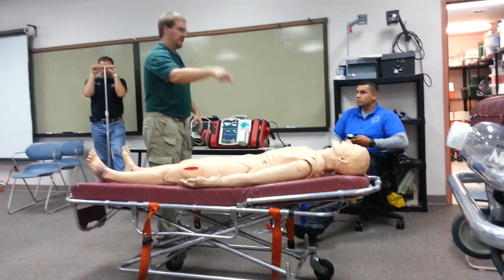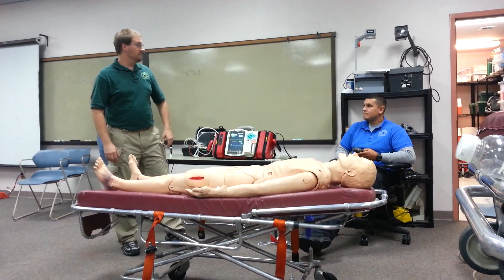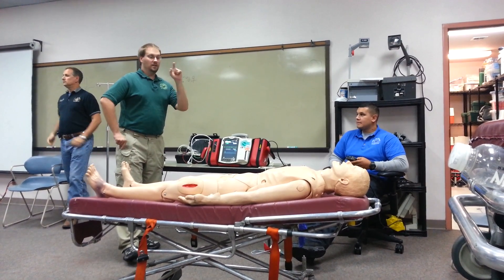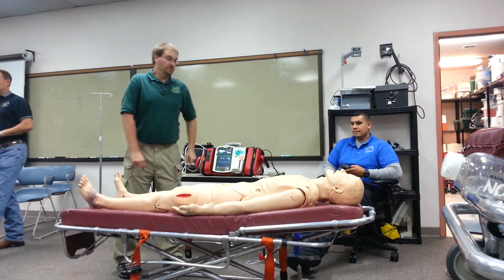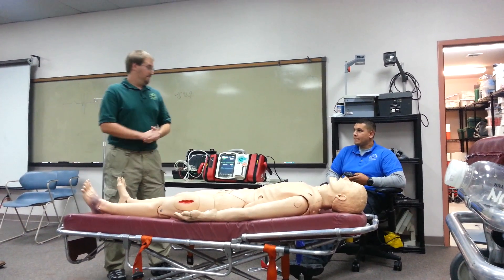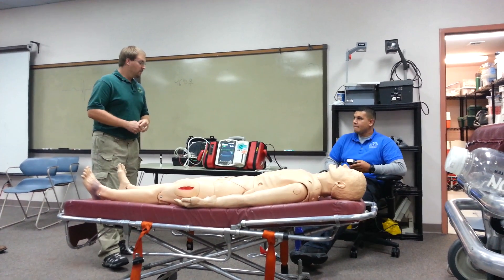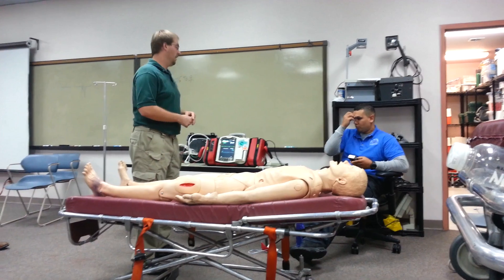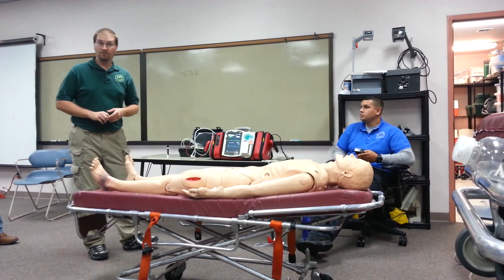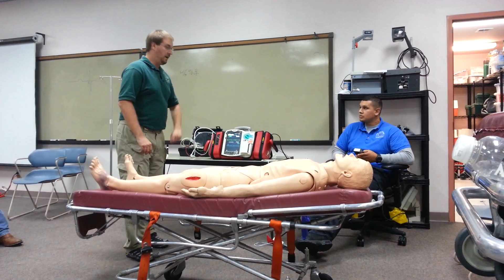Go right back into compressions. Let me know if the King LT is in and working correctly. We're going to continue CPR for two minutes, continuing to rule out the 5 H's and T's. I want to give epinephrine 1 milligram IV push, and have amiodarone 300 milligrams IV on standby after the epinephrine.